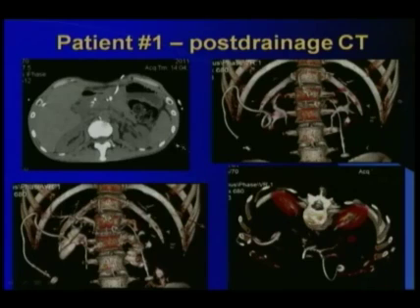So this is the post-procedure CT of this patient. You can see here the drainage catheter, which passes through the anterior abdominal wall, passes the anterior and posterior walls of the stomach, and it's placed in the Wirsung duct. This is the 3D reconstruction. You see the PTC catheter located in the gallbladder. You see the Wirsung duct drainage catheter, and this is the catheter which was placed in the necrotic fluid collection due to pancreatitis.